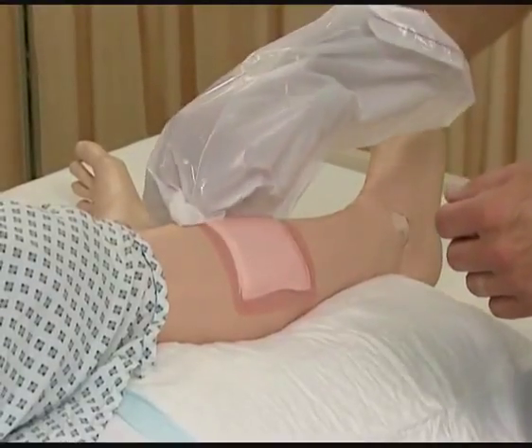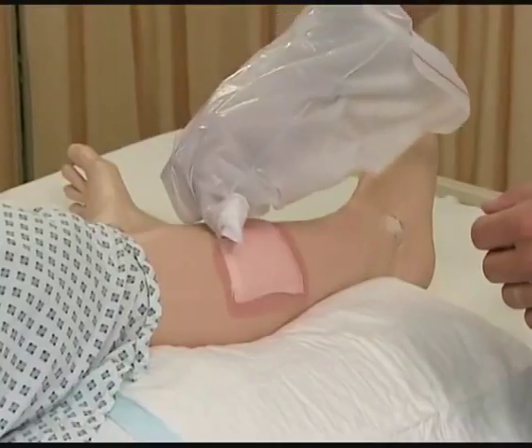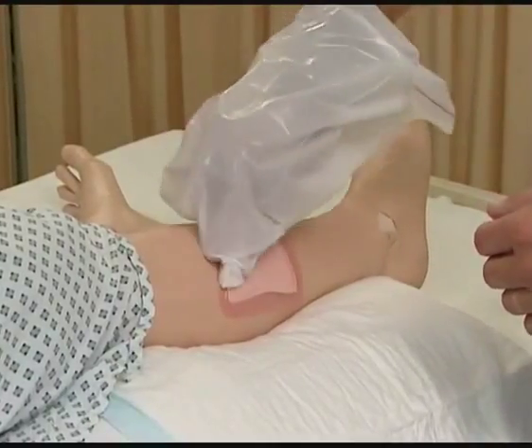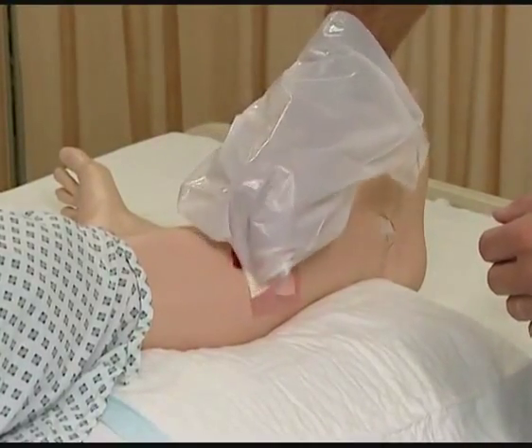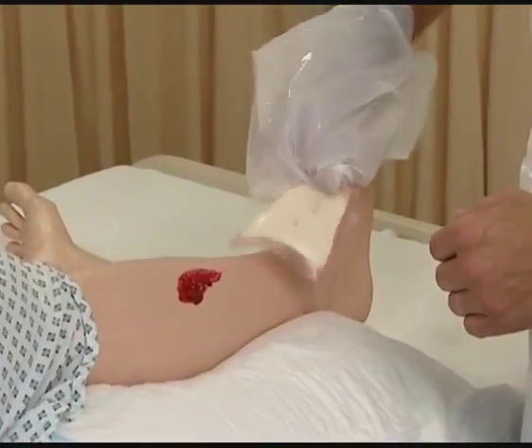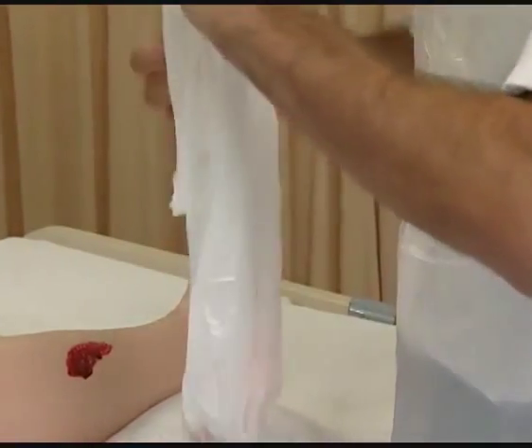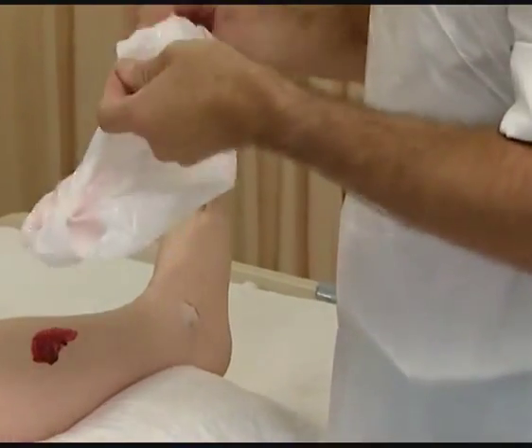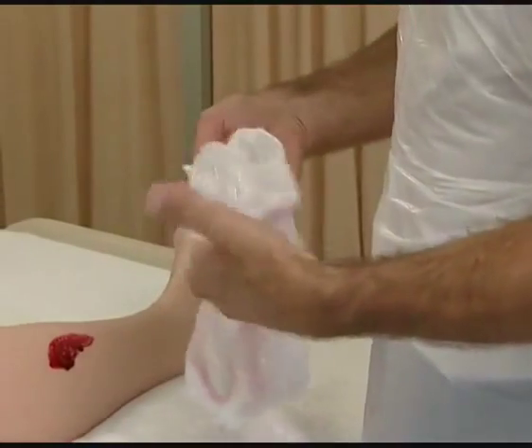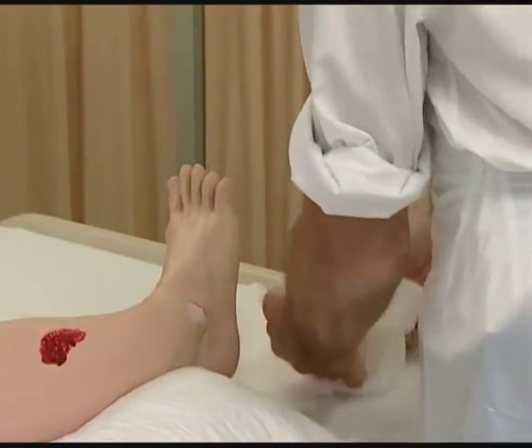Using the hand-in-the-bag technique, remove the old dressing. However, if this is difficult, you may require the use of gloves. Invert the waste bag and attach it or place it conveniently so that items can be dropped into it without touching.